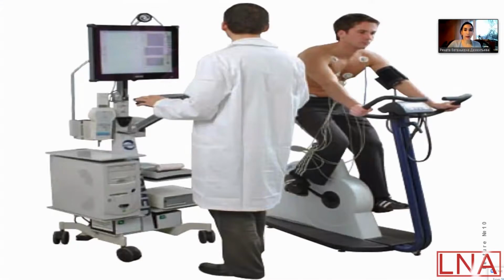And look at this picture, yes, under the doctor's control, the load is increased for the patient to assess, first of all, the blood pressure response and to detect the maximum level of blood pressure, which can be a signal to stop the test. And also during this activity, we determine the ECG of the patient.